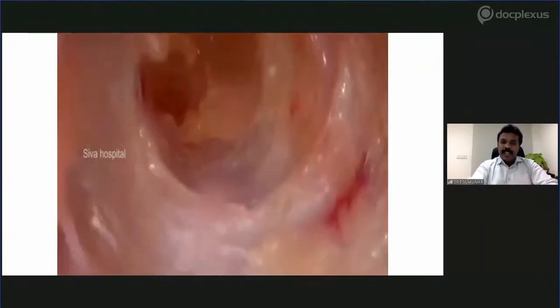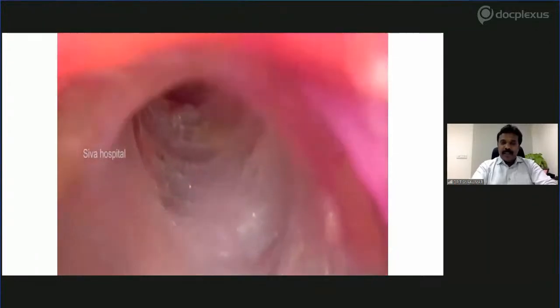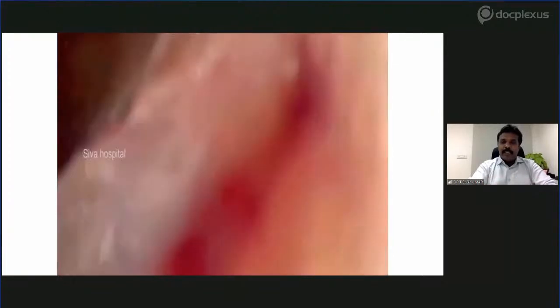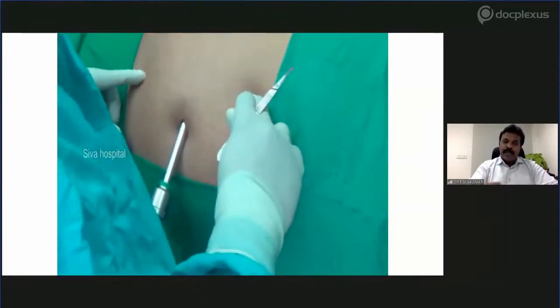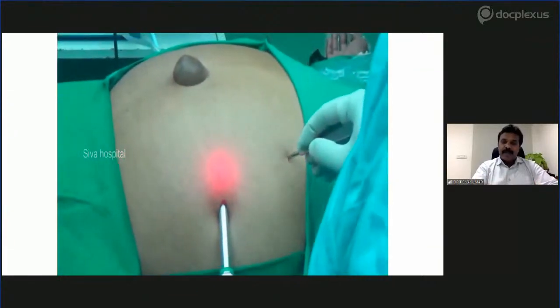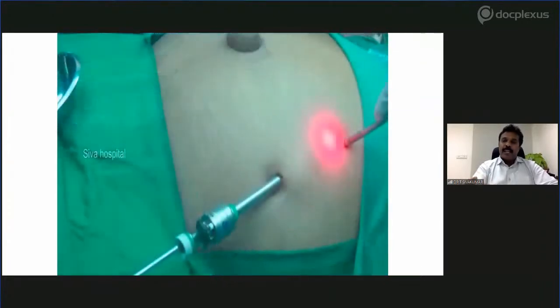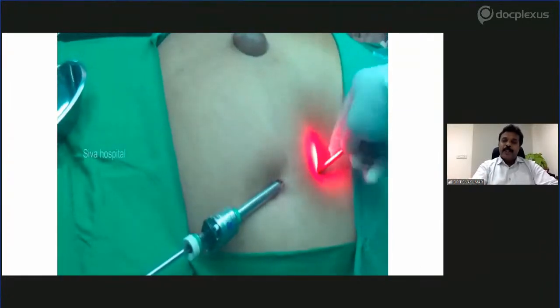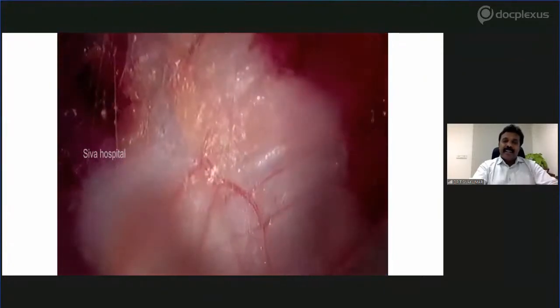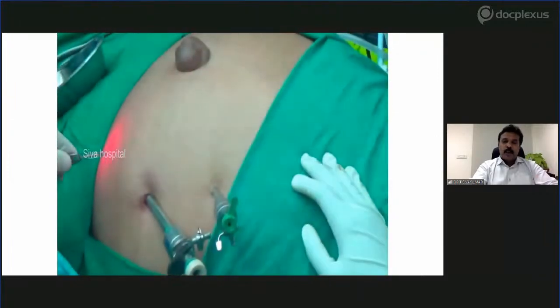Now where you are entering is the subcutaneous plane, Scarpa's fascia. Just dissect from there with your 10 mm 0-degree scope, with a to-and-fro approach, at 16 mm Hg pressure. You will be creating a plane in the subcutaneous plane. Then introduce your 5 mm port in the mid-clavicular line, right side, under visualization with the 0-degree scope, or you can change to the 30-degree scope.